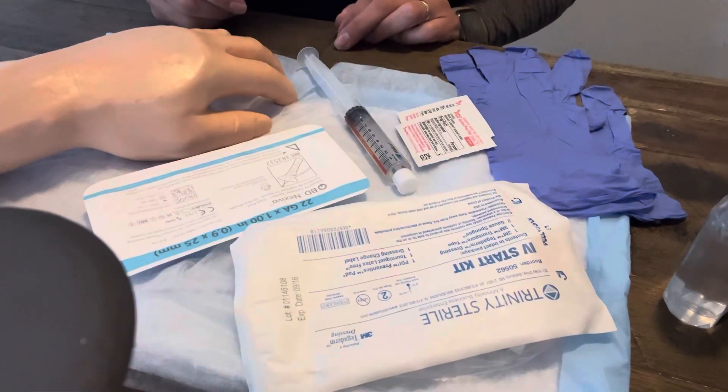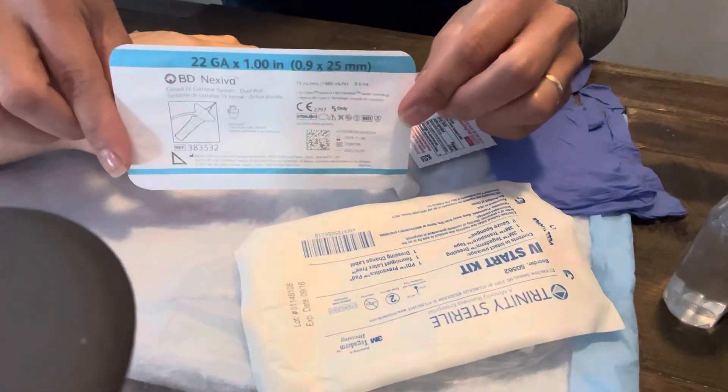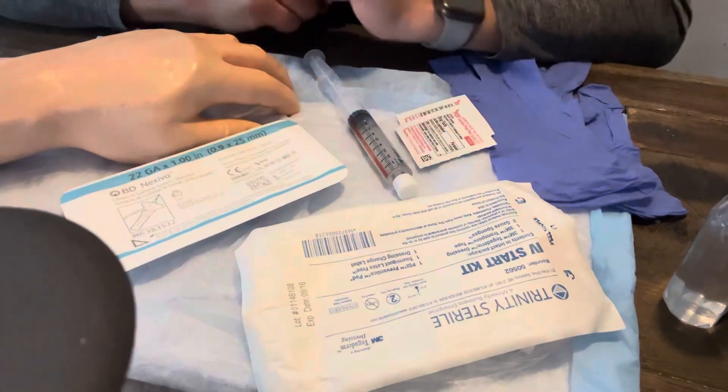Let's say we have a patient with an order to get an IV, so we're going to start the process. We want to identify a vein and grab our supplies. This is a common IV catheter found at the local hospital I work at and at the clinical sites many of our students go to.